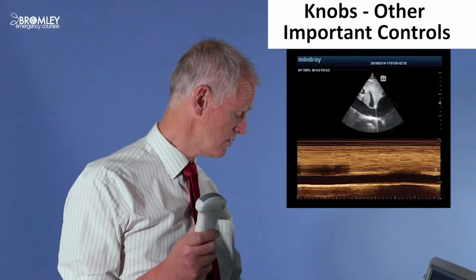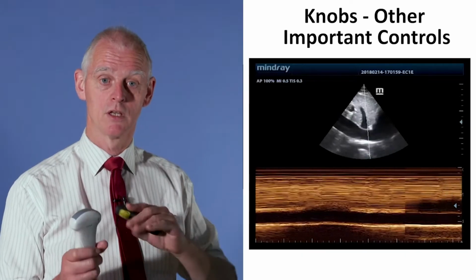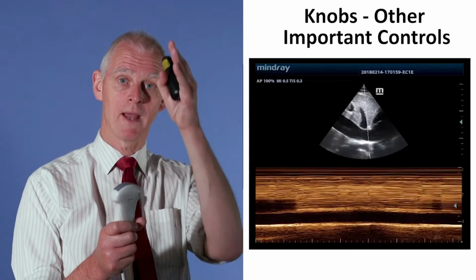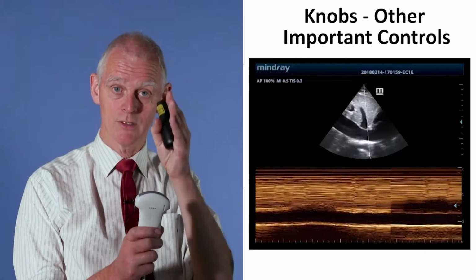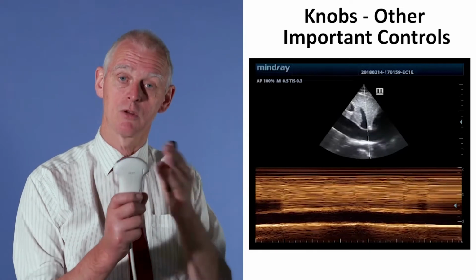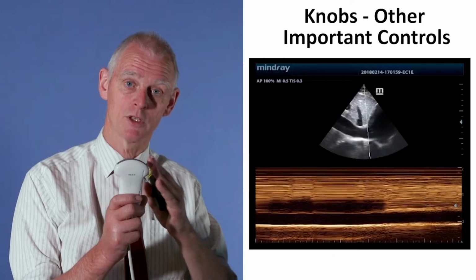If I set this little video going here, you'll see that the information along the bottom is what's come back to that one crystal, that single crystal, over the last, well, it turns out to be 7 seconds. So if anything on the image is moving, then we can see that movement stretched out over the last 7 seconds on the screen.